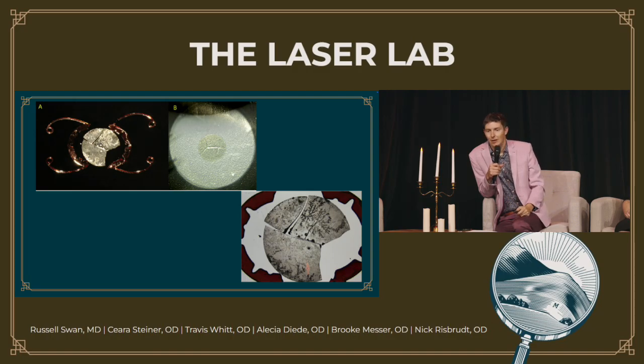And it turns out it was actually a totally fine lens, and then the YAG laser was brought to market. And the first time somebody yagged one of these, they realized that was not a really good idea because it shatters literally in the eye when you yag it. So if you ever were to see just a really, really weird haptic design on a patient that had surgery many, many moons ago, it's worth making sure that that's not the case. Unfortunately, if they have PCO, they're going to have something done. But the ideal in that situation would be to remove the lens, do a surgical removal of the PCO, and put in a new lens.